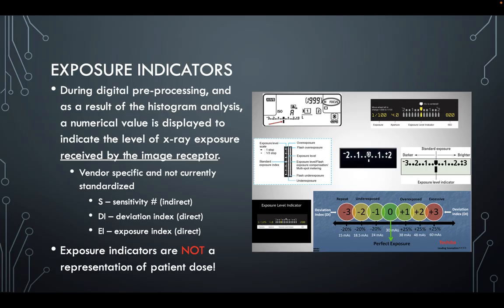That is what I'd use for my femur, and I'm using this just as an example. If that's not the femur technique Leah taught you, please don't come at me. So I took a femur at 30 mAs, and that's what my receptor was expecting, so it gives me a 0 here. It's like, oh, that was a perfect representation of this femur. I got the information that I was expecting. And then hopefully your image looks perfect as well.